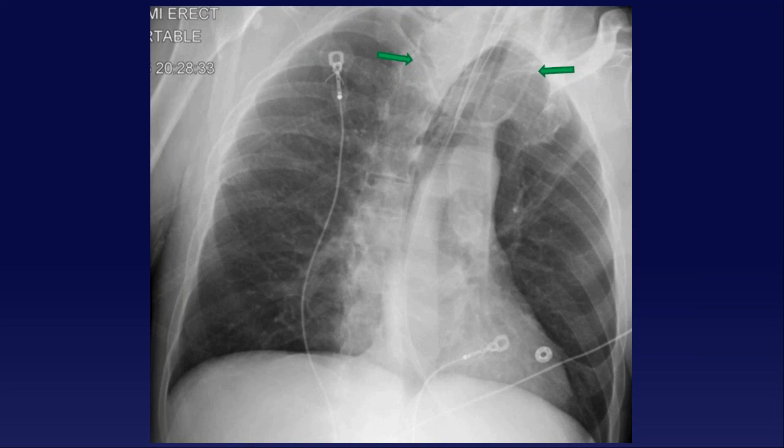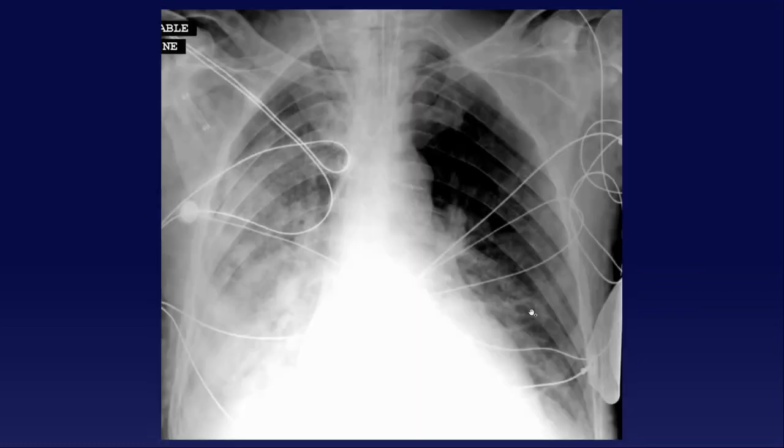So generally speaking, what you're saying is accurate. And if somebody has a lot of catheters present, like some of these ICU patients who have numerous central catheters, an internal jugular catheter, a Swan catheter, a pulmonary arterial catheter, sometimes you might have so many catheters on one side you want to move to the other. Or if you've got an infection at a catheter insertion site, you might need to switch sides. So you're correct, very often it might be easier on the right side, but sometimes you have to move to the other side. But that's a great question. Keep the questions going, guys. These are great. I'm going to make sure people understand this stuff.